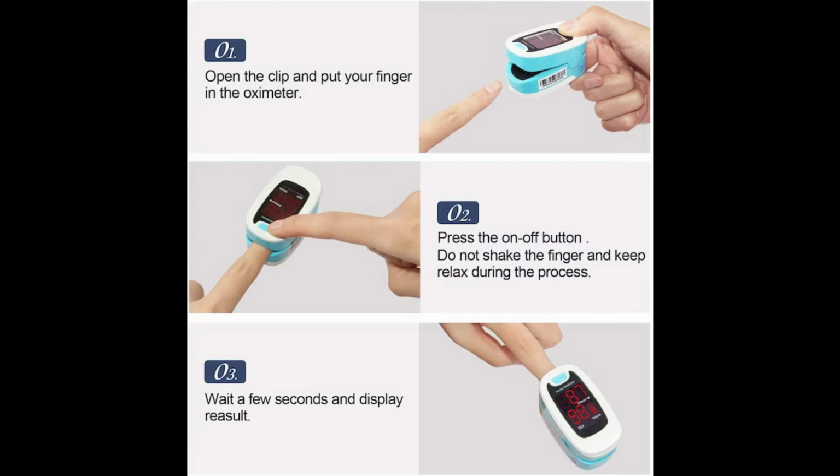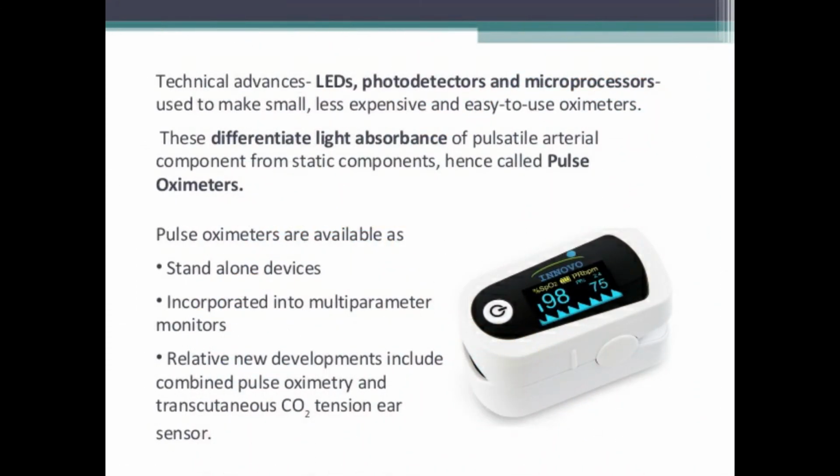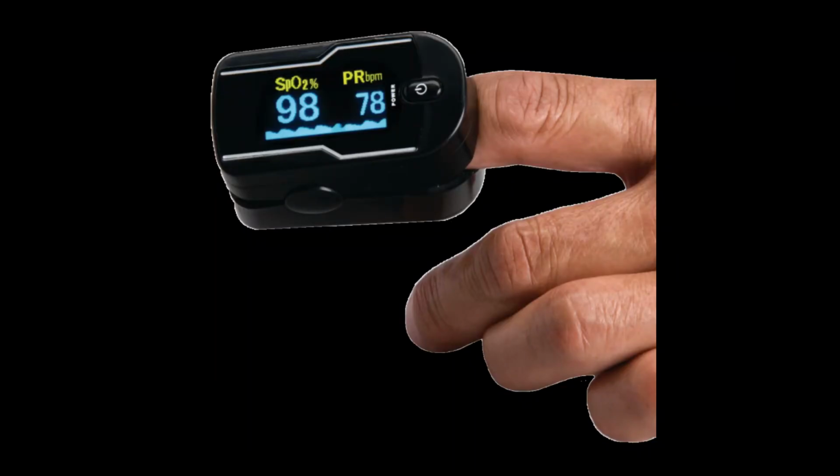So knowing the importance of the device, I hope you may buy it and keep it with you for personal or family use, if you wish to. But all hospitals and most doctors have a pulse oximeter where you can go to do your health assessment if you feel any discomfort. People with heart or breathing problems can rely on personal finger pulse oximeters to help them monitor these conditions under physician guidance. For example, individuals with asthma can leverage personal oximeters to assess the severity of attacks and exacerbations.